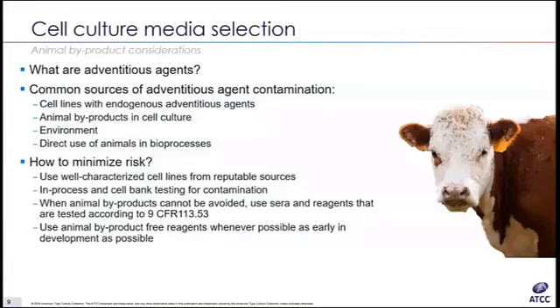All right, now that we've discussed basal media and primary cell growth kits, let's dig into another point of consideration when selecting reagents for your cell biology workflow: animal byproducts. Animal byproducts are derived from the blood or body of animals. Common animal byproducts used in cell culture are fetal bovine serum, extracellular matrix, and some growth factors. There's a few issues with using animal byproducts, including, and most often critically, the potential introduction of adventitious agents.